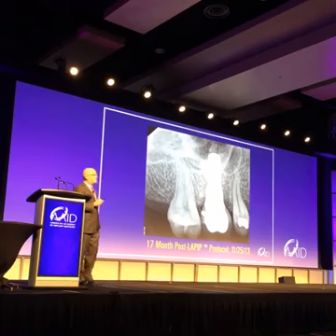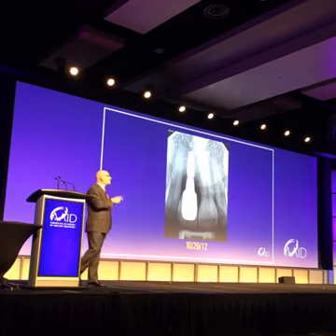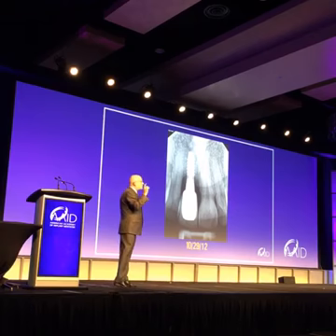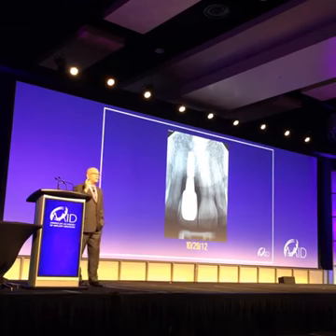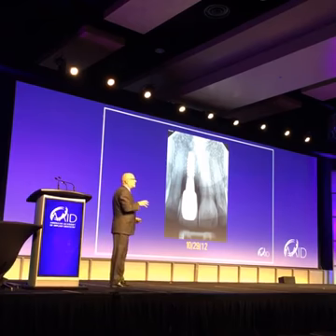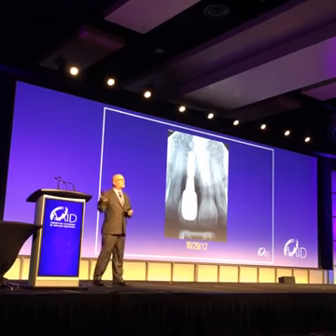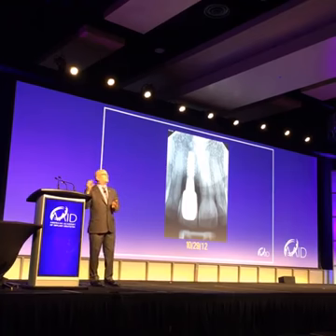That's important to realize. What about this tooth here? How are you going to treat the anteriors? If you read the literature or you go to lectures on periimplantitis, a lot of them show posterior implants. And they do all the surgery and everything else. What they don't show are the anteriors. What do anterior implants have that posterior implants don't? What's the one thing?